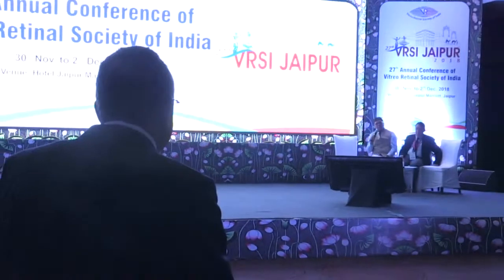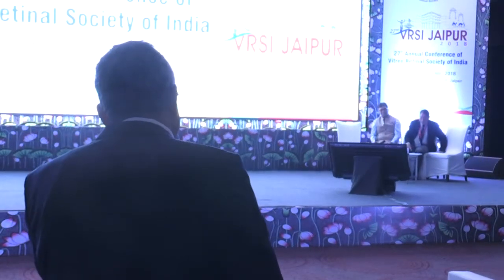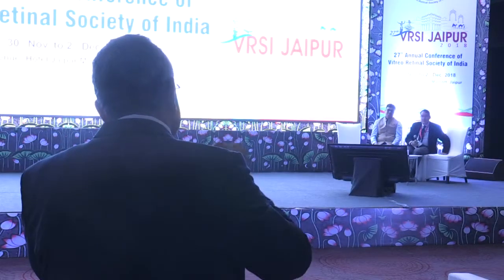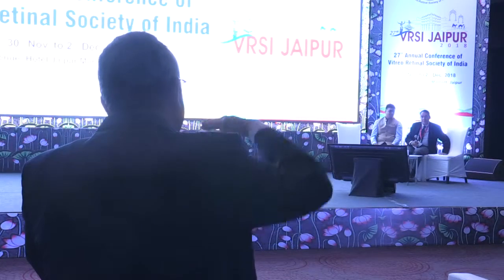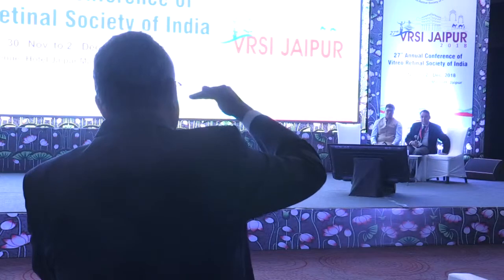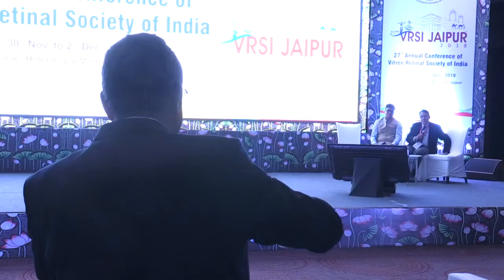Exactly. I have a question for Dr. Hani. Sir, you advocated complete drying of the retina in all cases of detachment. So in anterior break cases, do you use PFCL in every case? Yes. I use PFC in almost all cases of detachment to drain the subretinal fluid through an anterior break. For this, sometimes I do a fluid air exchange while keeping the PFC posteriorly and drain through the anterior break. While still under air, I use the sandwich technique to continue PFC injection above the level of the break. This minimizes the amount of fluid that will trickle back to the posterior pole at the end.